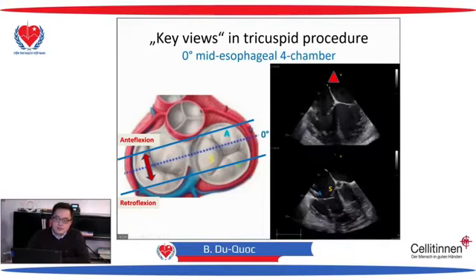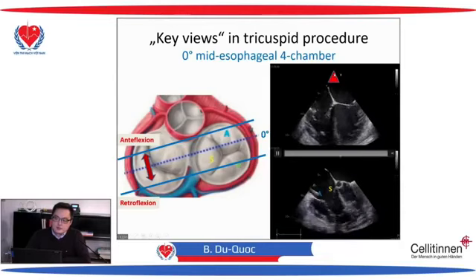Well, this view is characterized that you have your transducer next to the left atrium.